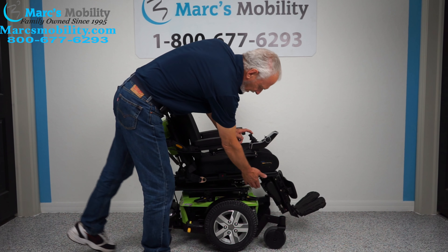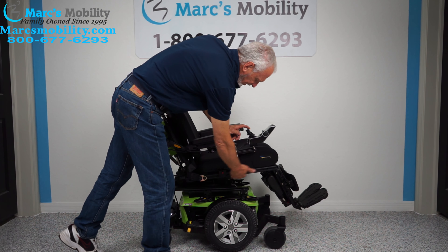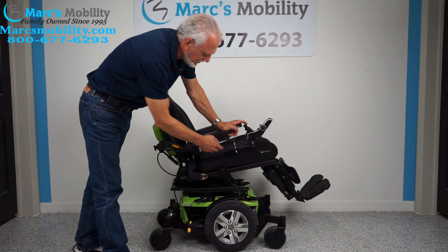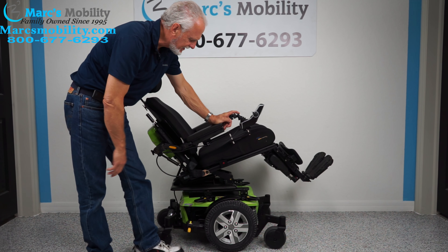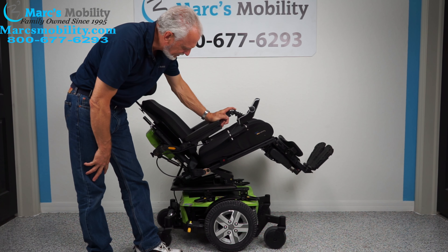What that does, you can see the electric tilt — that's the base going back. When the base goes back, it's going to take the legs and the back because they're all connected together. This is called the electric tilt.